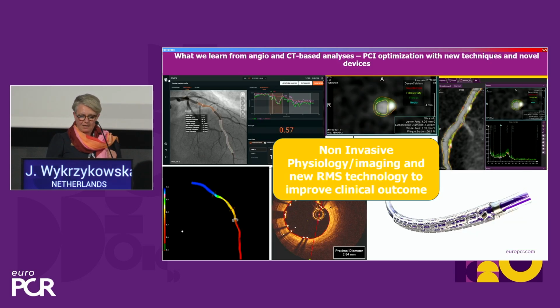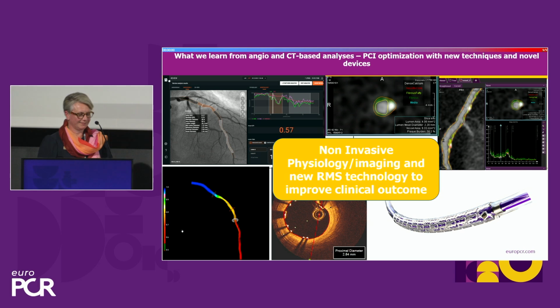And I think what was shown very nicely in the last presentation is that we now have a huge armamentarium of techniques, starting with the CT scan prior to the procedure, where you can get plaque features, then the CT FFR during your procedure, confirming everything and doing additional diagnostics and optimization based on QFR, and then when needed, perhaps also using intravascular imaging if you see that your QFR is not optimal and you want to pinpoint the problem. All right, thanks.